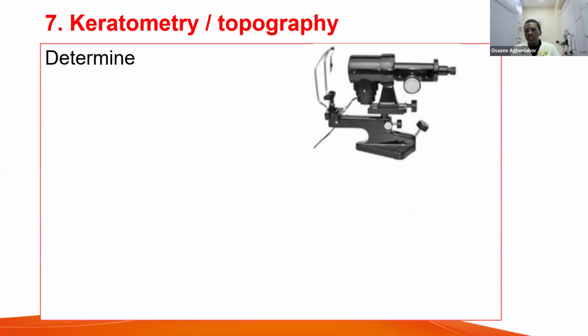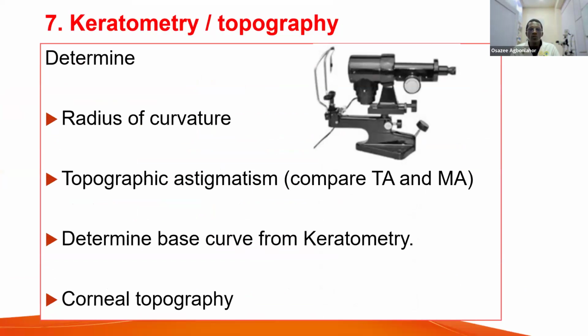Of course, you must do keratometry and all of that to know the radius of curvature. Just like the presenter mentioned yesterday, radius of curvature talks about the cornea, and it can also be converted to dioptric curvature. Just like he said, the steeper meridians have higher curvature and shorter radius of curvature.